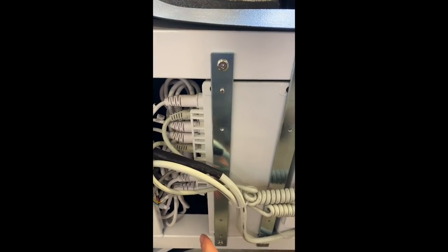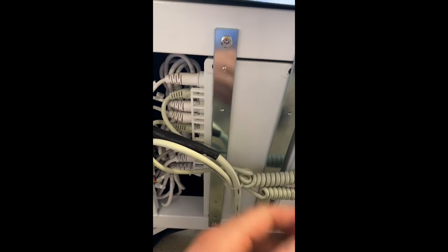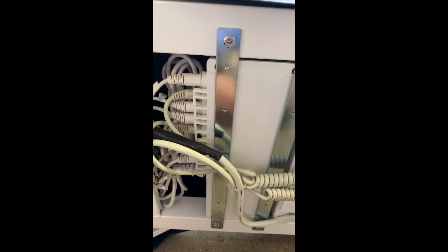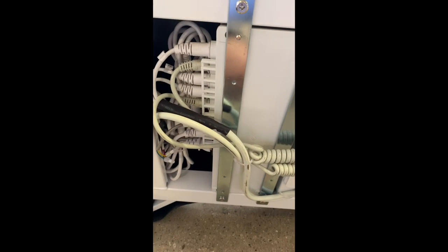The module box is the brain of the bed — it controls every single function on the bed. And that's pretty much how you troubleshoot the Palermo electric treatment table if no functions whatsoever are working on the bed. Thank you.